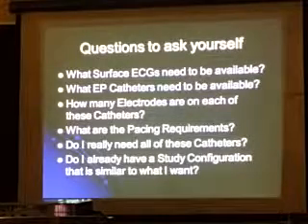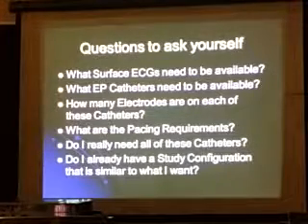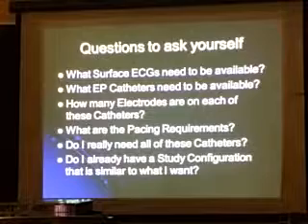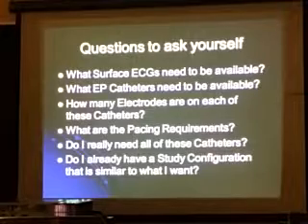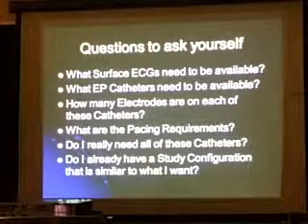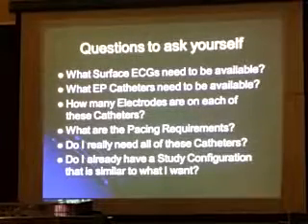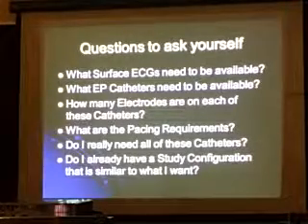If you have 5 study configurations, your case opens quickly. If you have 40, it can take a minute and a half to open while it processes all that data. And it does it every time you open the case. Because what happens if you open the case, but your field engineer came in because you had a bad amplifier and replaced it with something he had in his trunk really fast? And it's only 64 channels instead of 128. So that means it has to program it for that one. So every time you open a case, it recreates the program and list for how to run that particular amplifier. And it doesn't do it for just the one study configuration, it does it for all the study configurations, because you might switch halfway through the case. And it's got to be ready to go.